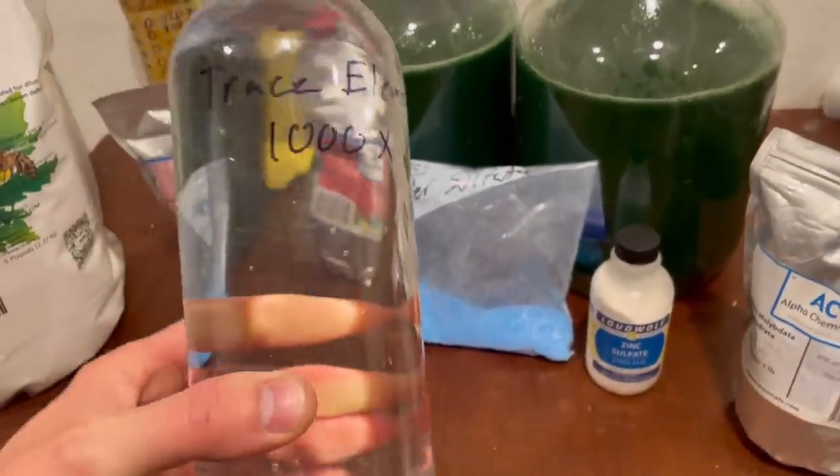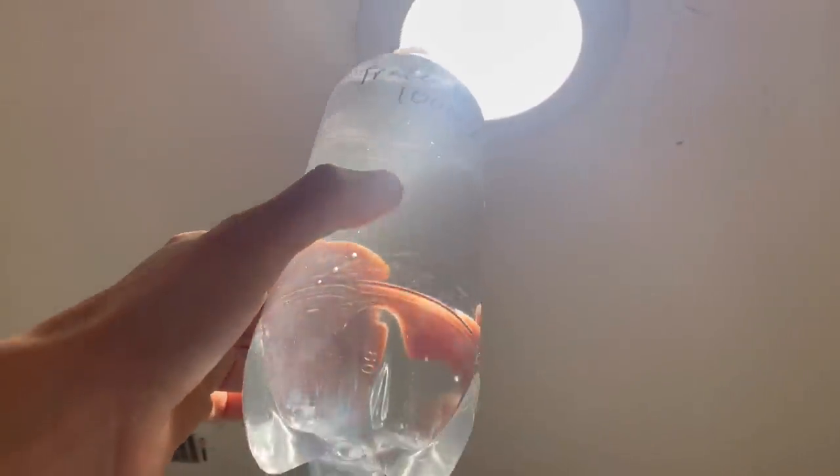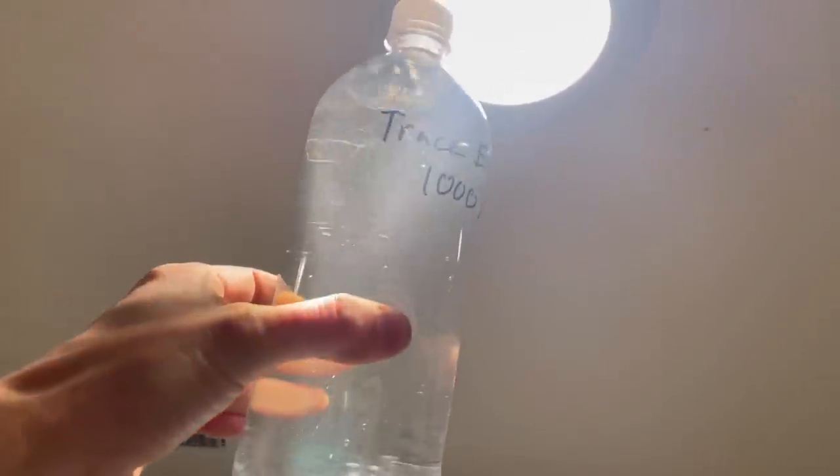And there it is — much less blue. Honestly, the color should have been a tip-off. It's a bit embarrassing that I missed it, but you can see it is much more clear with very little sediment in this one.